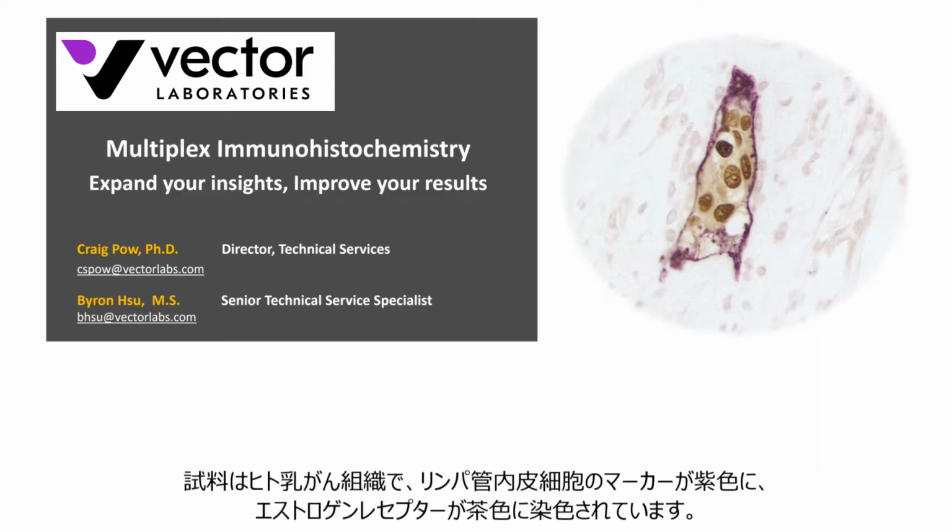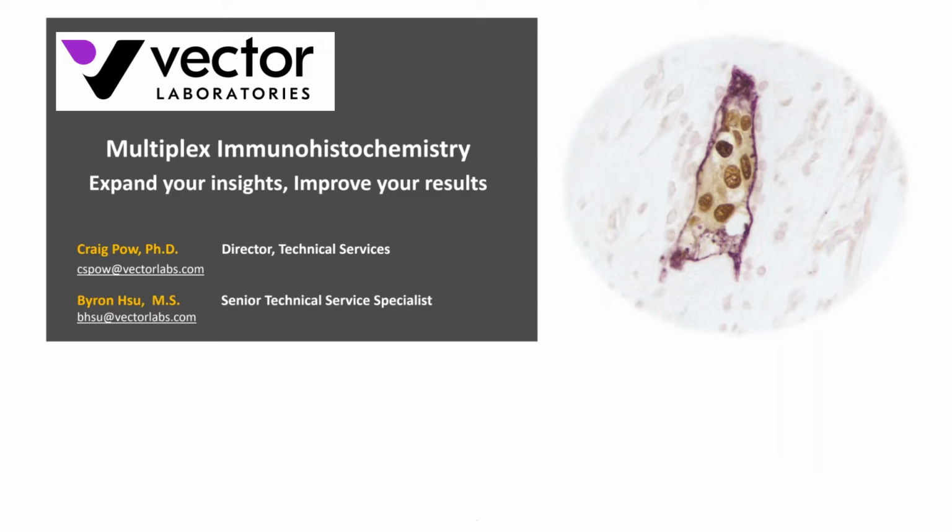On the right-hand side of this title slide, I have a great example of double labeling. This is a section of human breast carcinoma stained for a lymphatic endothelial cell marker, highlighted here in purple. The other marker is estrogen receptor, which is highlighted by the brown staining in these particular cells.